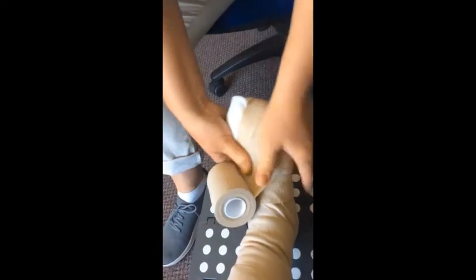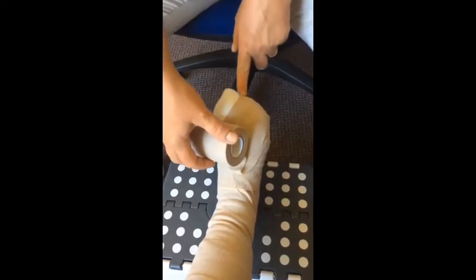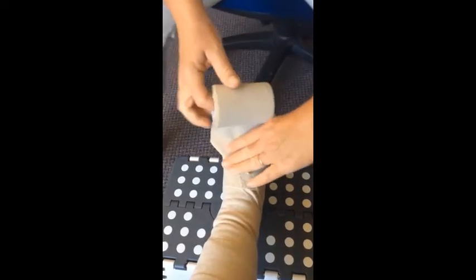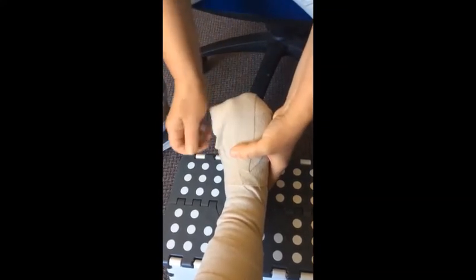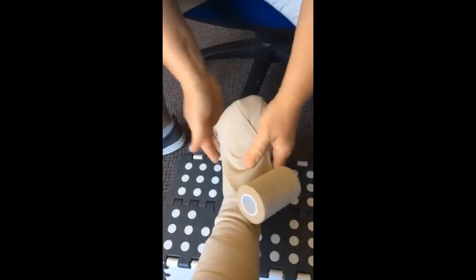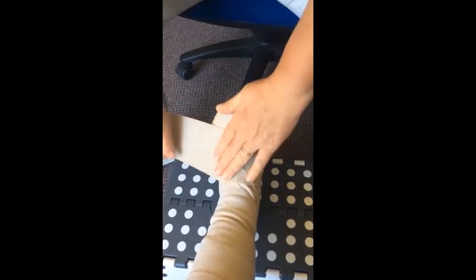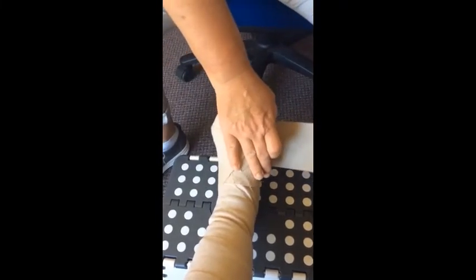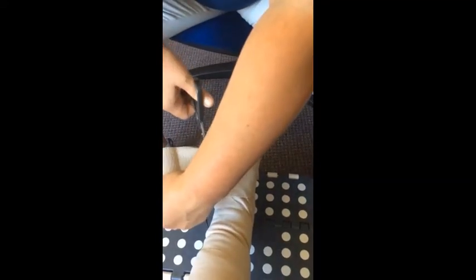Because this bandage is sticky you don't have to hold your fingers inside — you can stick it down, fold it over, and then head off in the next direction. So there's the middle of my bandage at 50% overlap, stretch down to the middle of the foot underneath, stick it down, and soften that out. Stretch back over the top. I'm nearly there — in fact I probably am there. What I'm going to do now is just do one more turn around the foot to bring all those little sticky-out bits together, but again I don't need any more compression around the foot so I'm taking the tension off — this is just to secure it.